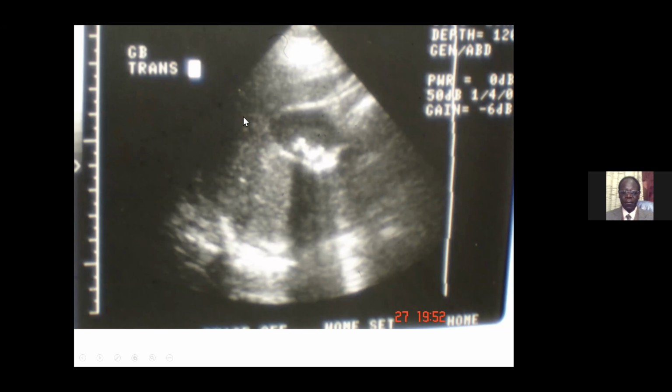We are in the liver again. This is a gallbladder, but there are multiple hyperechoic areas in the gallbladder with acoustic shadowing. Ultrasound cannot go beyond these hyperechoic areas. So these are actually gallstones, multiple gallstones, and this is how we diagnose them.